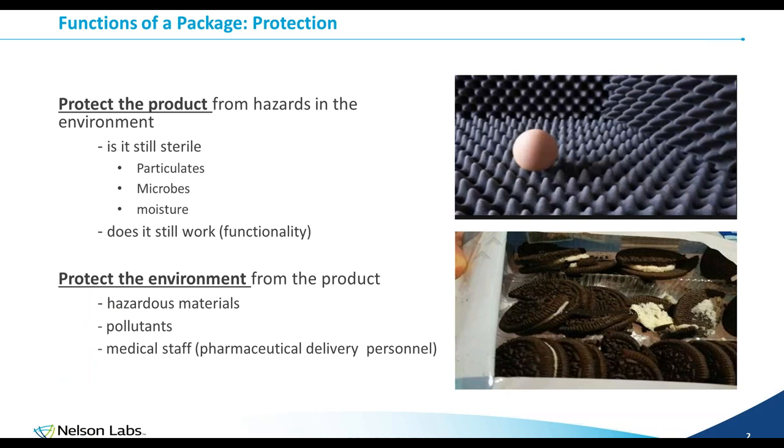So basically, what is packaging? Why have a package? If you think about it, there's no product you make that can get to its end user without any sort of package, whether it's a cereal box, a bottle of water, a box of nails, and in our case, a sterilized medical device. So what are the functions? There are four basic functions.